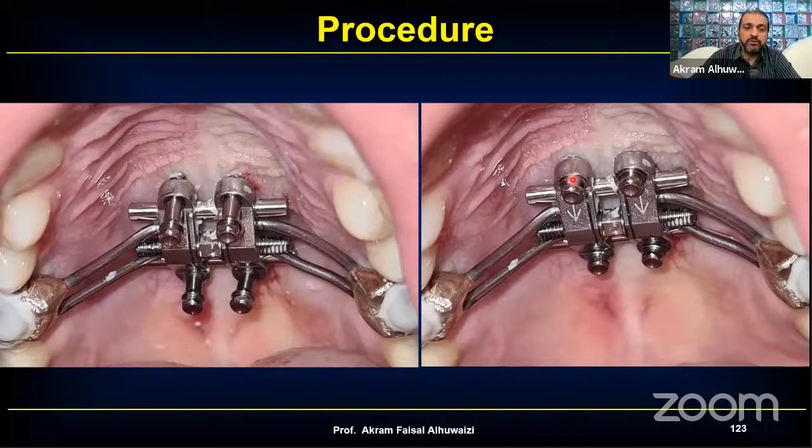Sometimes the patient will feel some pain or tingling sensation as you go through the nasal mucosa. Sometimes they don't. In my experience, in most of the cases, they don't feel it. Probably because I give anesthesia. I've heard of people who just numb the area with local anesthetic. Probably in there, they're going to sense it.